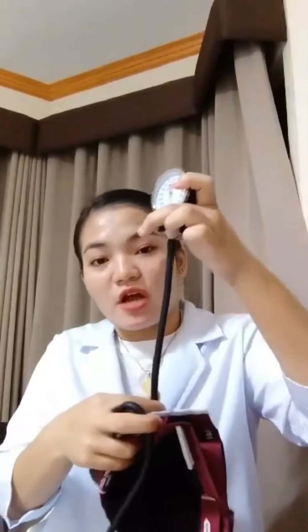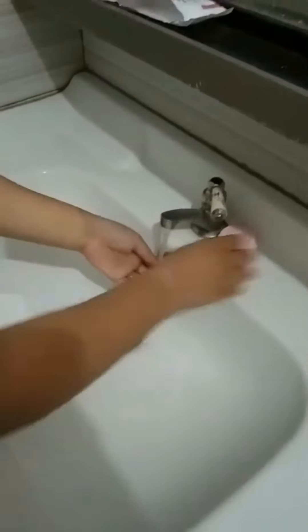This is the BP set. This is the sphygmomanometer. This is the rubber tube. This is the valve. This is the release bulb. This is the cuff. This is the stethoscope. This is the diaphragm. This is the rubber tube, the metal tube, and this is the earpiece.